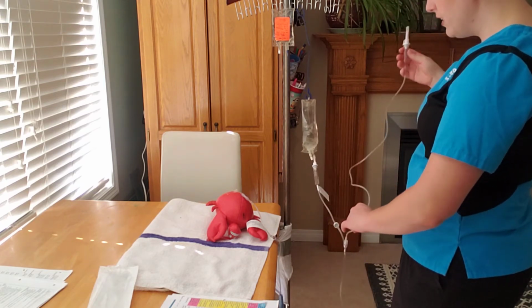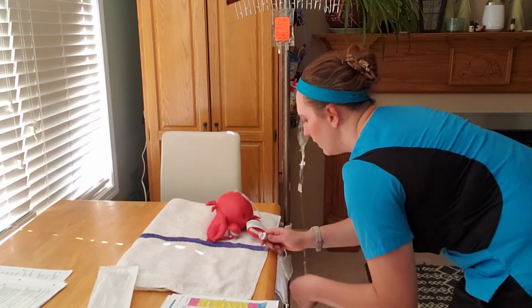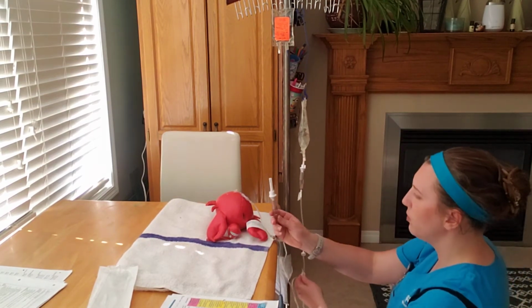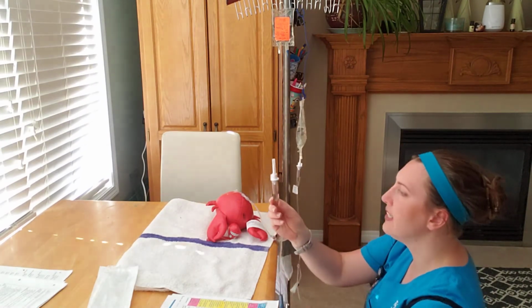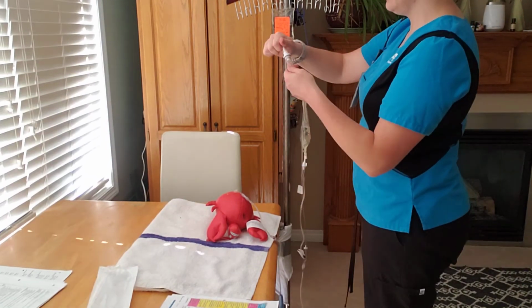So what I'm going to do is I'm actually going to back prime the line by holding it lower than the bag and opening this. I'm going to keep this over here, and what I'm looking for is my drip chamber to fill between 1/4 and 3/4, and that's where it's at now. It's at just over 1/4 full. So now that it's primed, I'm going to avoid touching anything after.